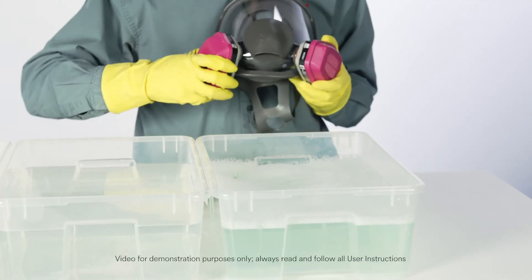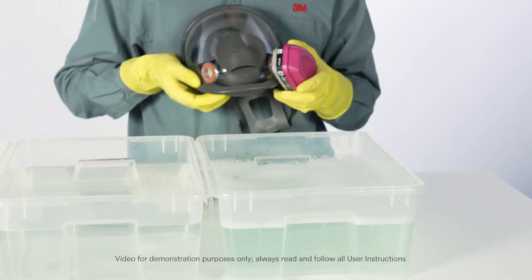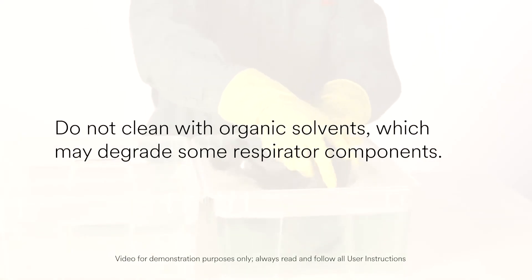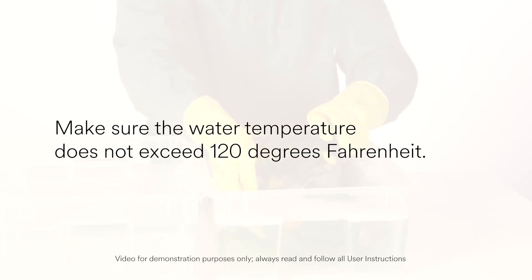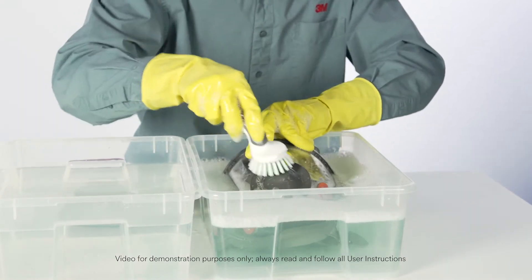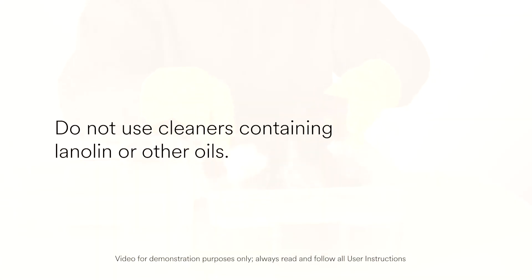Clean the facepiece between uses by removing cartridges and filters and immersing in warm cleaning solution. Do not clean with organic solvents, which may degrade some respirator components. Make sure the water temperature does not exceed 120 degrees Fahrenheit. Scrub with a soft brush until clean. Add neutral detergent if necessary. Do not use cleaners containing lanolin or other oils.